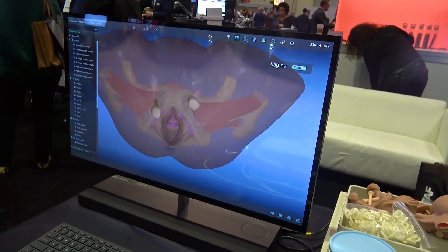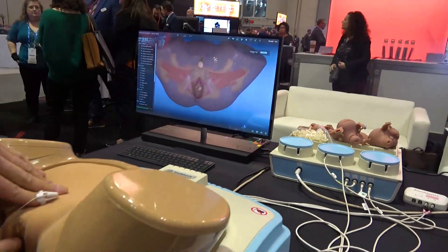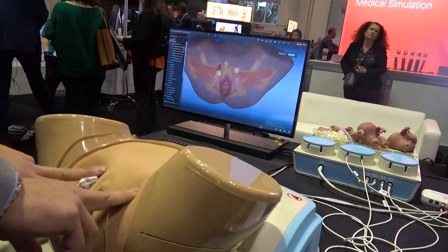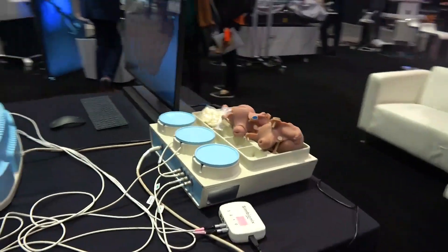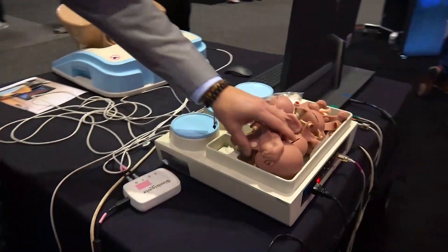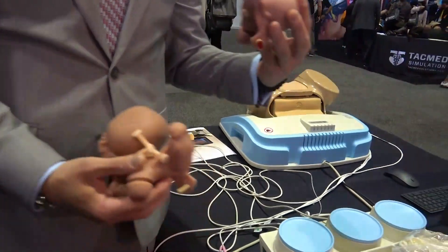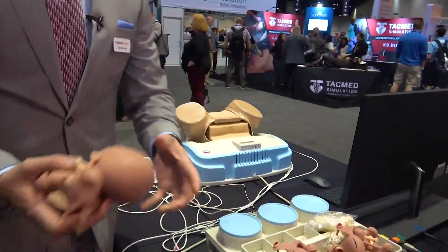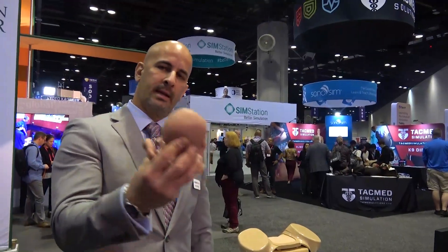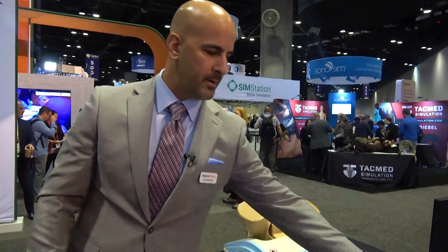They have to palpate and understand what they are touching. Once they identify something, they need to determine what is wrong with it. This simulator uses a wide range of uteri with various conditions — such as an ovarian cyst, a normal uterus, or a multi-parous uterus. Instructors can change the uterus inside the mannequin, and students must palpate and identify the patient's condition.